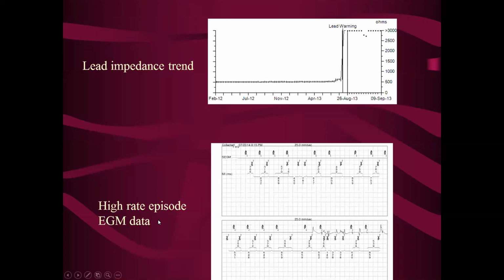We can also see issues with tension on the wire, or make-break type of fracture, from the high rate counter. If you can visualize the two ends that are broken, if they're intermittently rubbing against each other, it can actually generate false potentials intermittently when they make contact. And these are non-physiologic signals. They're just like noise artifacts. And so we might also be able to pick those up in the high rate counter of the pacemaker.